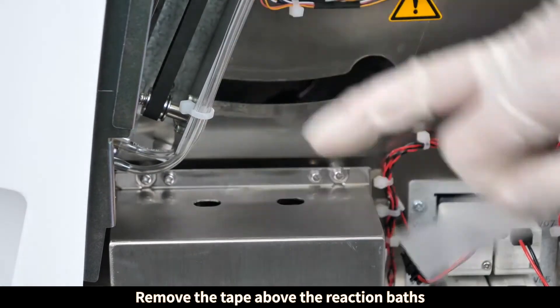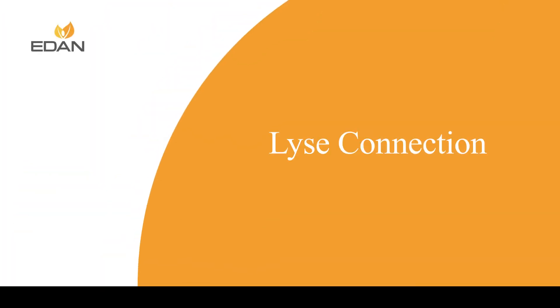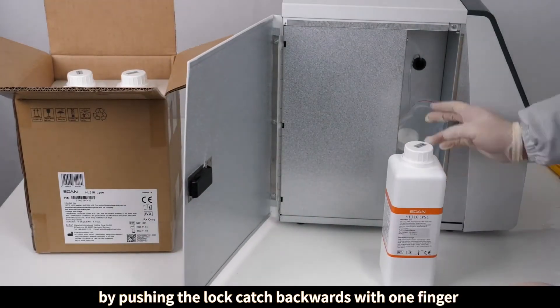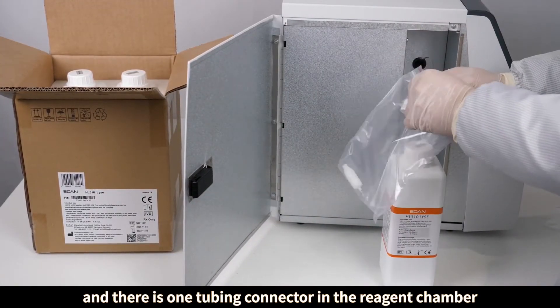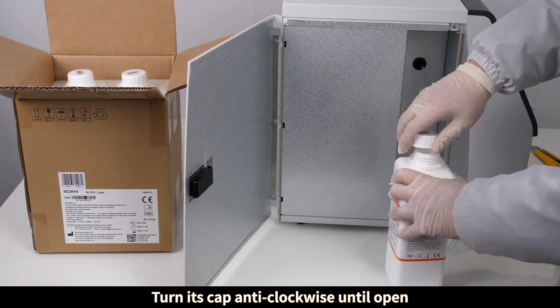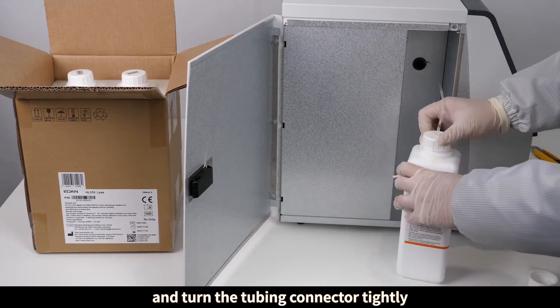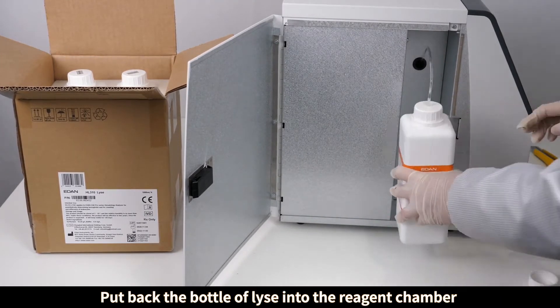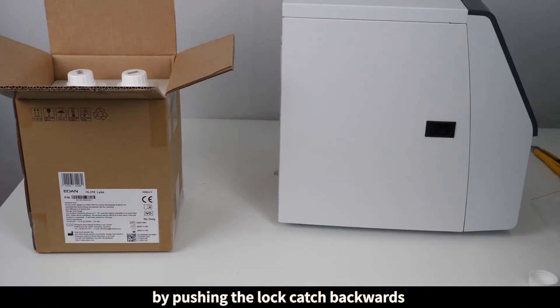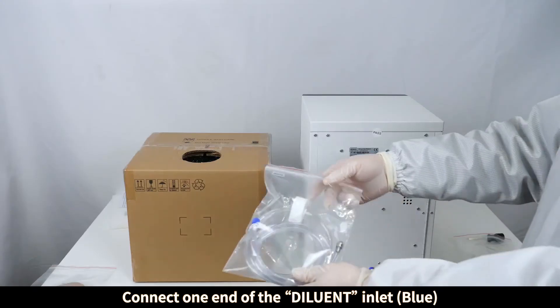Open the reagent chamber by pushing the lock catch backwards with one finger. There is one tubing connector in the reagent chamber. Take out a bottle of lyse, turn its cap anti-clockwise until open. Insert the end of the tubing connector into the lyse bottle and turn the tubing connector tightly. Put the bottle of lyse back into the reagent chamber and close the reagent chamber by pushing the lock catch backwards.